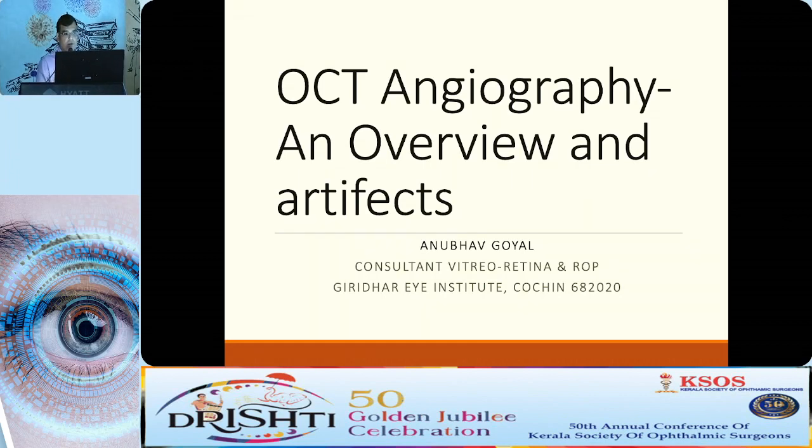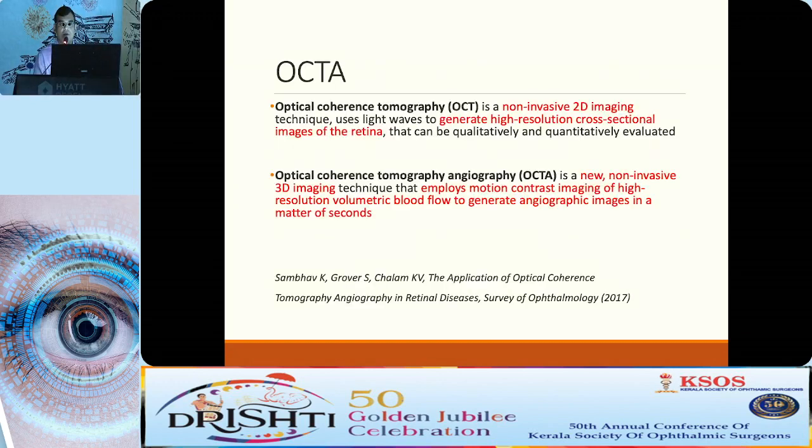So my talk is on OCT angiography, an overview. Basically, what my colleague has told, OCT is an additional instrumentation in our armamentarium. Good for institute use, but for private practice it might be a doubtful investigation modality. There's a basic thing which we all use now in and out in OPD, which is OCT.